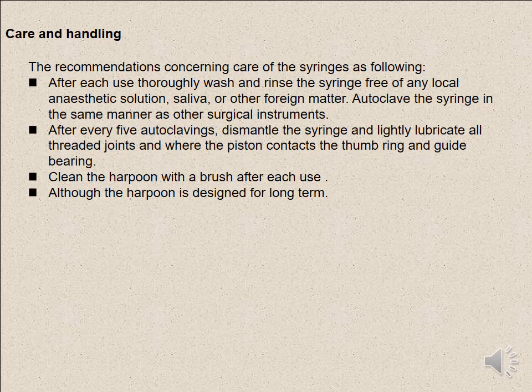After every 5 autoclavings, dismantle the syringe and lightly lubricate all threaded joints and where the piston contacts the thumb ring and the guide bearing.